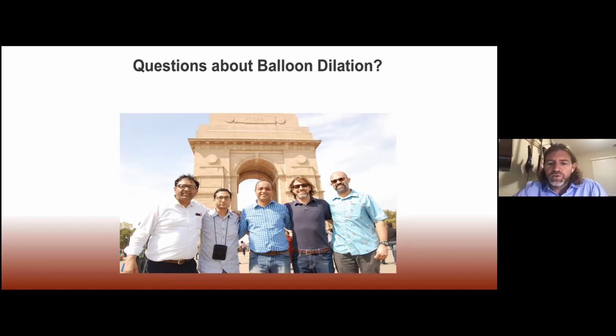Also patients, as mentioned before, who have a very long segment of narrowing. It's tough to treat longer segments of narrowing with a balloon. Not impossible, but you're up against a larger challenge. And as far as cricoid rupture is concerned, I haven't seen a cricoid rupture with a balloon, in the sense that we're not causing a controlled rupture of the cricoid, because we do, as mentioned, perform these anterior and posterior cricoid splits.